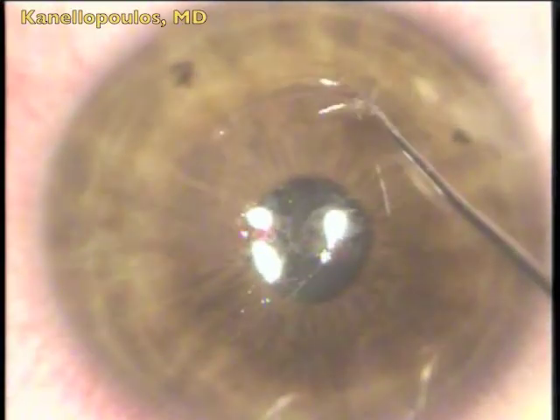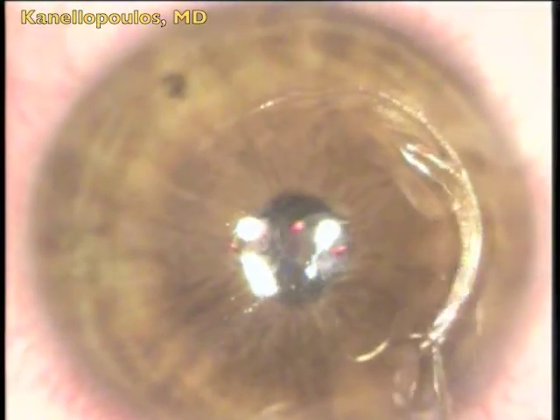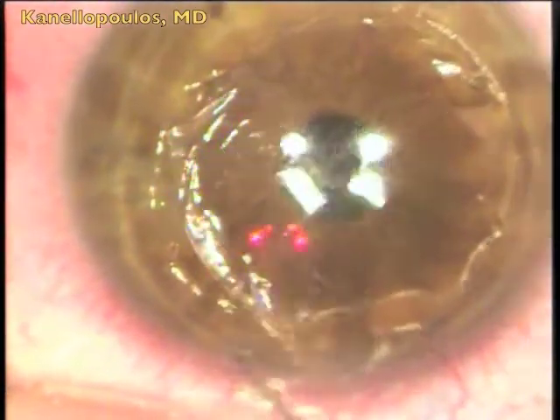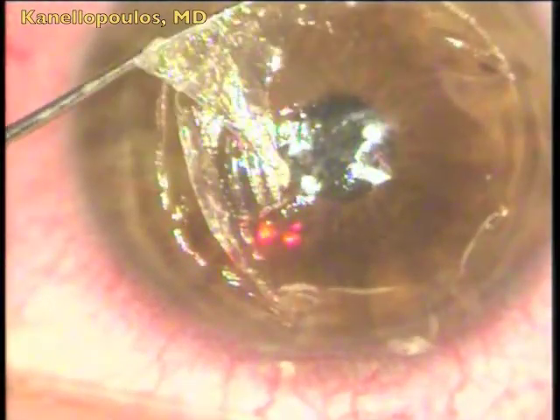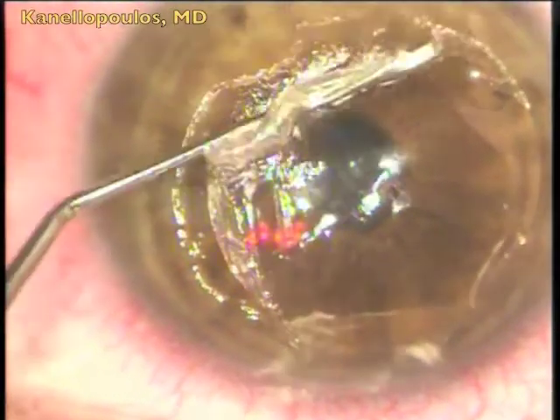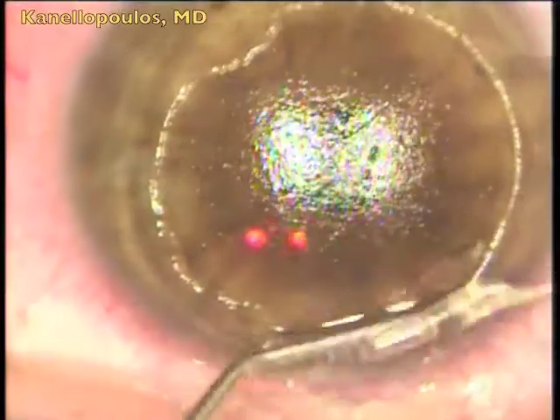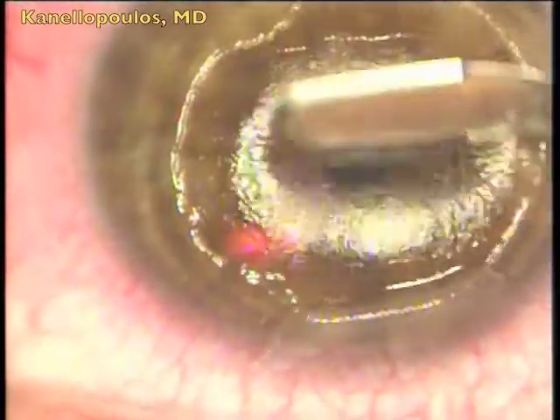I'll describe our technique, which we also use in primary LASIK for flaps. We're going to go in with a Szynski hook, pulling from in to out, to prepare the flap so I don't displace free bands of epithelium. I'm going in with the Szynski hook to free the flap, and then I'm going to use preheated spatula instruments. This is the Crescent blade — I'm going to try and remove the epithelium from the bed.